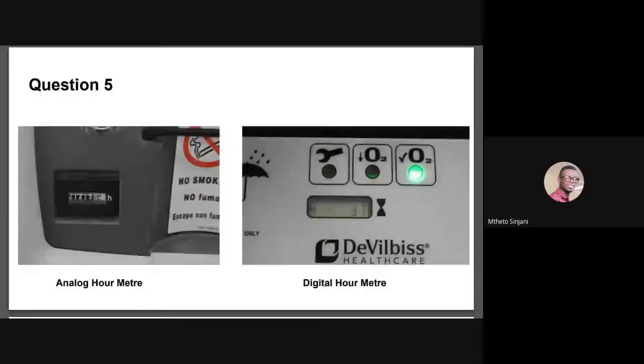Okay. So an hour meter is also referred to as a Hobbs meter. Hobbs was the first company to make a meter like this, so this is how it got that name. Hour meters were first used in aircraft to keep track of how many hours have been flown. This information was used to schedule routine maintenance of the aircraft.